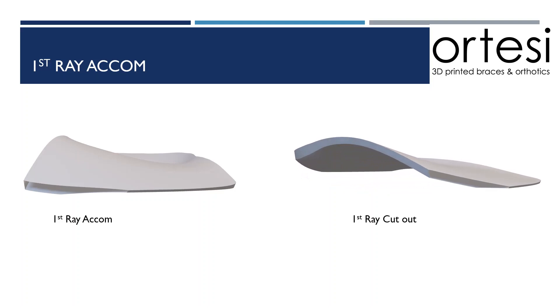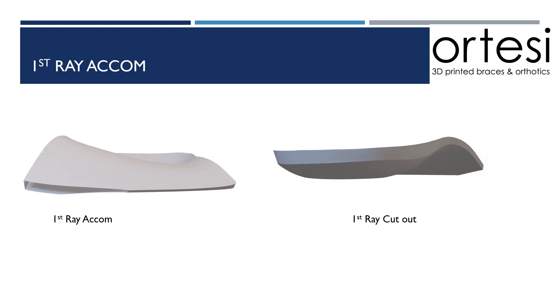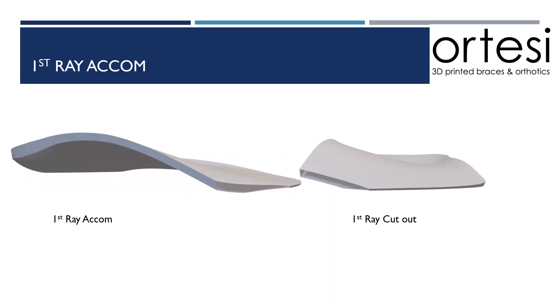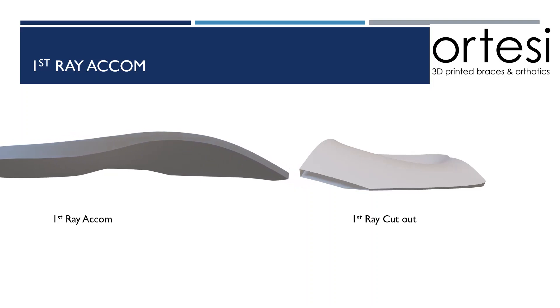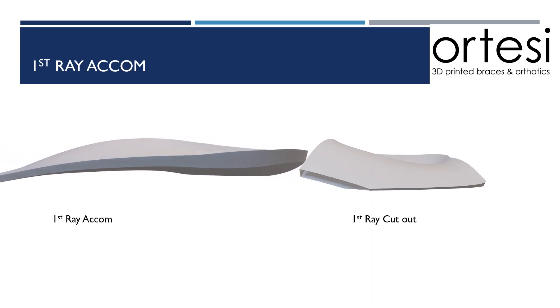With the first ray cutout, you can see that the medial distal edge of the shell is no longer in contact with the ground. Whereas with the first ray accommodation, you can see that the medial distal edge is plantar grade, making for a more stable modification.